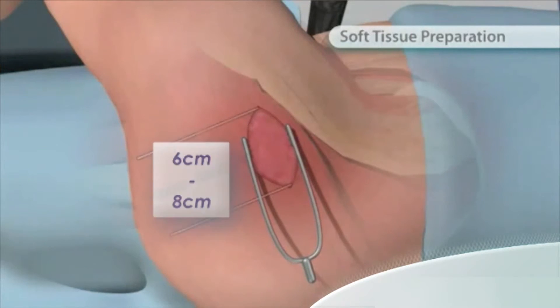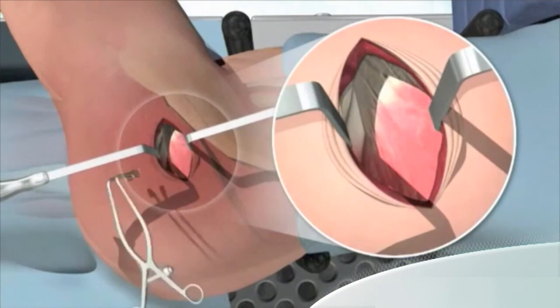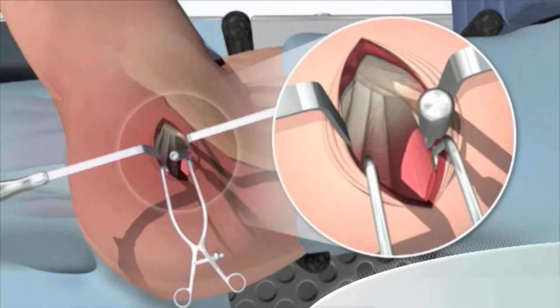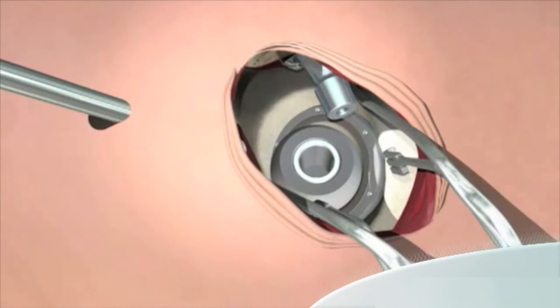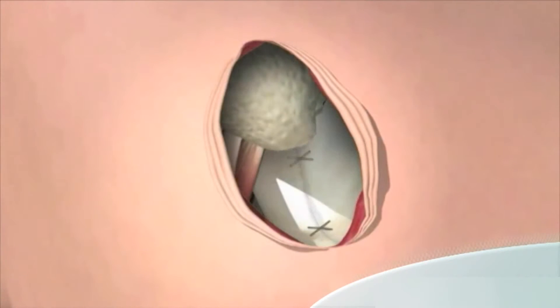SuperPath is a very innovative way of doing a hip replacement. It is essentially a technique that allows us to perform this operation in a manner that preserves the muscles and ligaments at the front and back of the hip joint that are usually cut to gain access to the hip joint. This makes it the least invasive technique when considering the soft tissues around the hip joint.